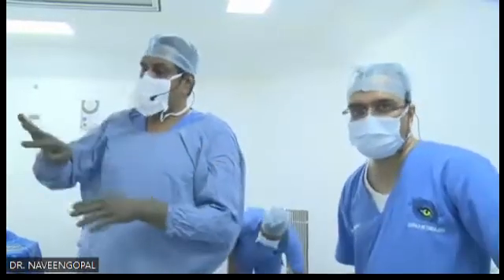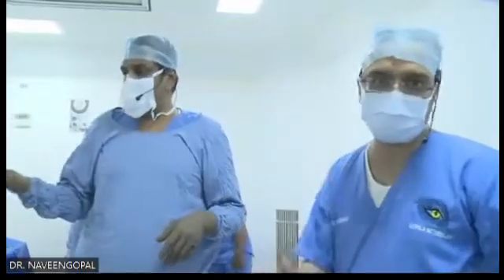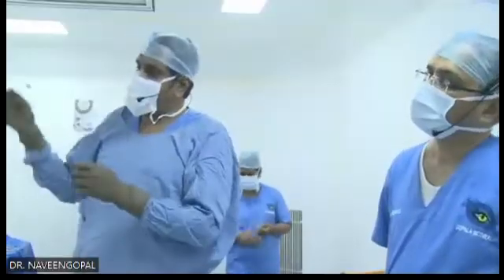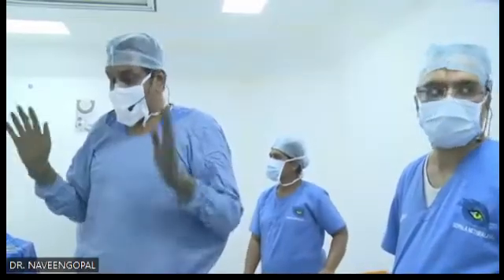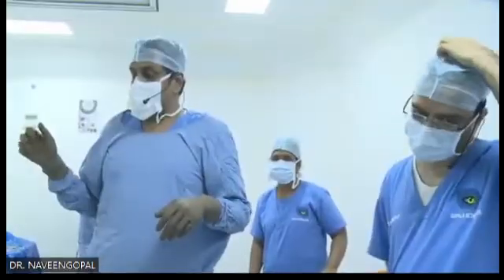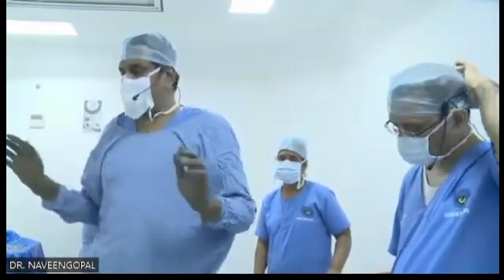So the question is, can we re-implant the same lens? Yes, you can re-implant the same thing. If the lens is not damaged, I re-implant the same lens. But I have seen a few people who flip the lens inside the AC. Please don't do that. That is never indicated. That causes endothelial damage for sure. Forget about endothelial damage, it causes cataract. So many other problems. No, never do that.